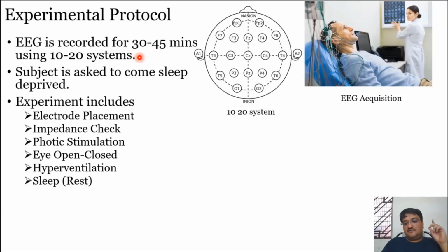First and foremost, if you go for any epilepsy EEG test, they will ask you to come sleep deprived. They will ask you to complete only 4 to 5 hours of sleep and then come for the test. Why that is required is because sleep deprivation is one of the kindling factors for epilepsy. If your sleep is not finished, there are very high chances that you will show some epileptic behavior, or your brain will discharge biopotentials at a higher rate compared to a person who has had sound sleep.